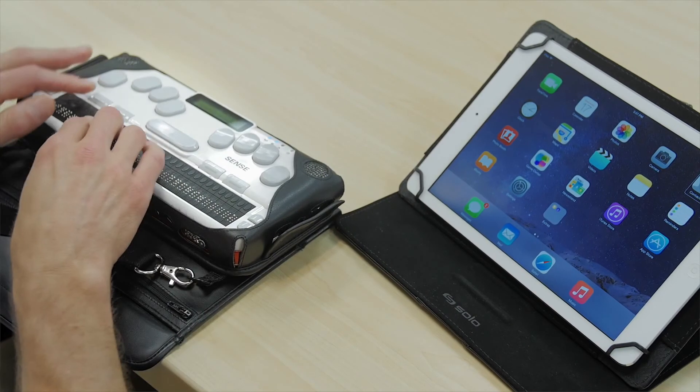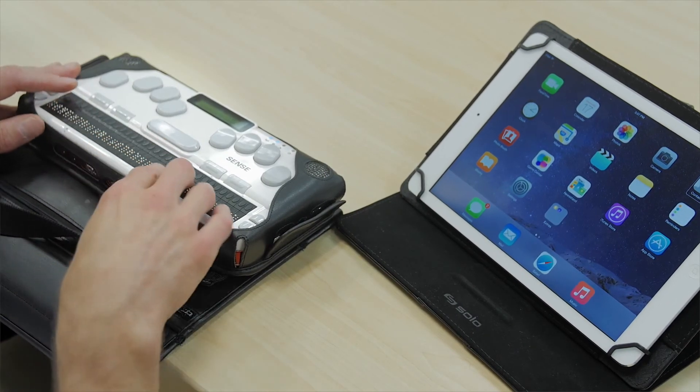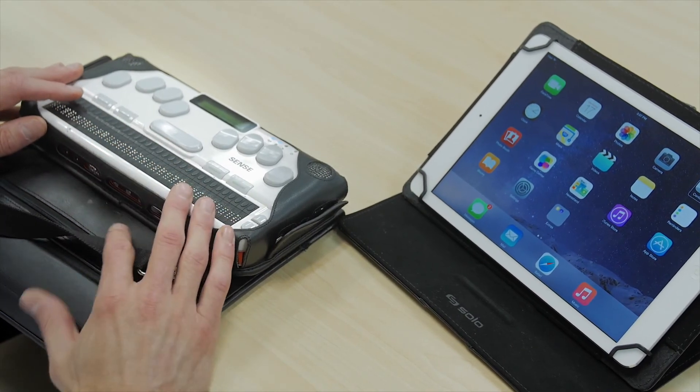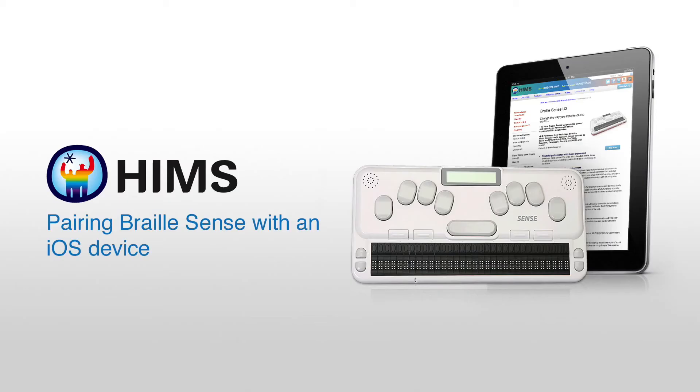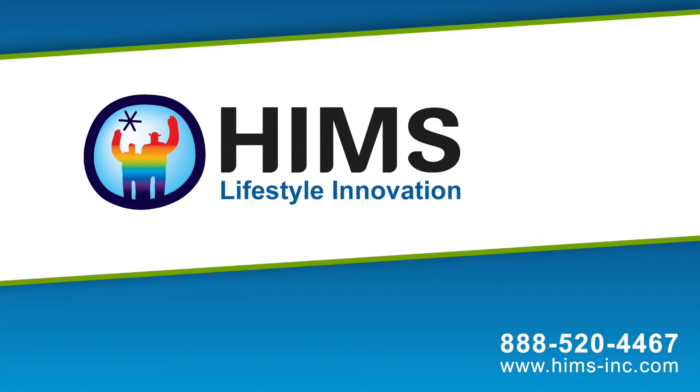Terminal for screen reader S. And now I'm back on the note taker side and I've disconnected from my iPad. And that's all there is to it. Hims. Lifestyle Innovation.